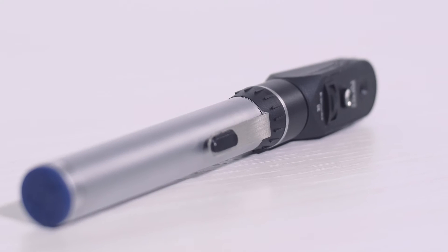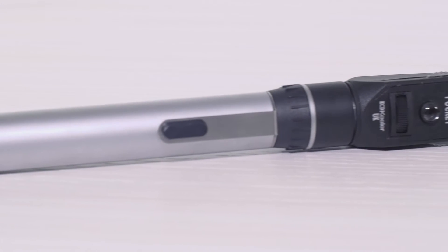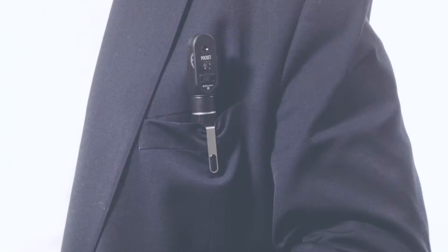The Keillor Pocket Ophthalmoscope is ideal for practitioners on the move. In addition to the Keillor comprehensive lens range, the pocket model is portable and features a belt clip.